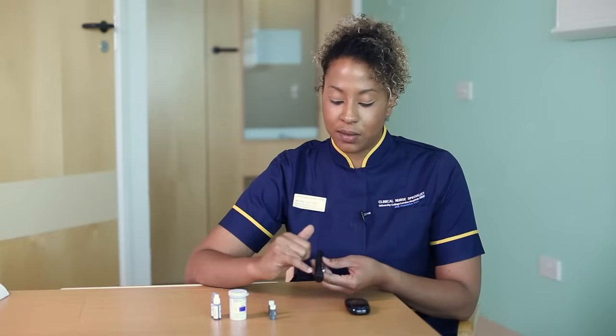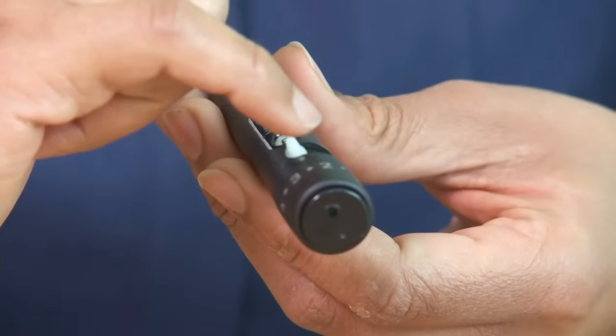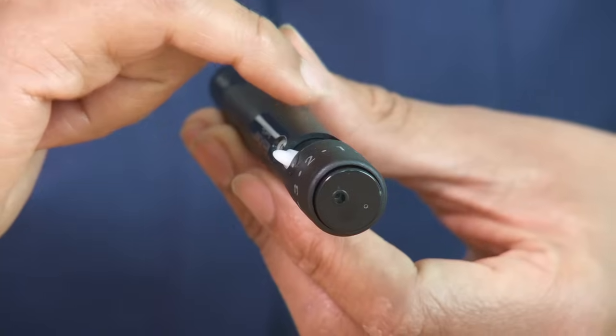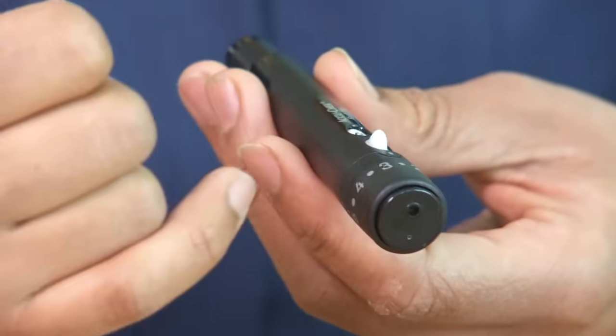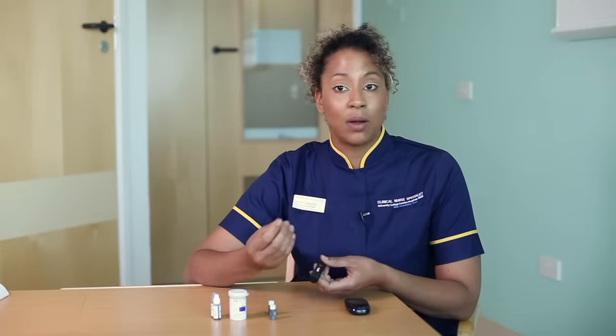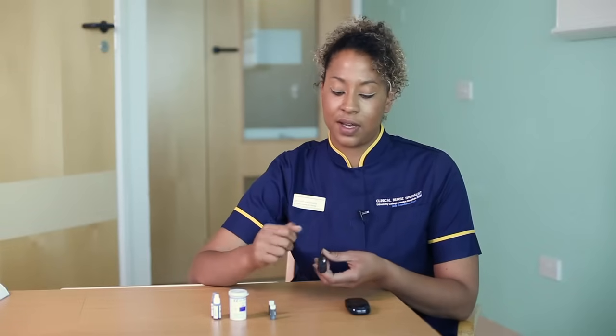You'll notice there are some numbers at the bottom of the pen, and this corresponds to the depth at which the lancet pricks the finger — one being the shallowest and number five being the deepest. It's very much dependent on each individual child, how long they've been pricking their fingers for, and how thick the skin is on the ends of their fingers.